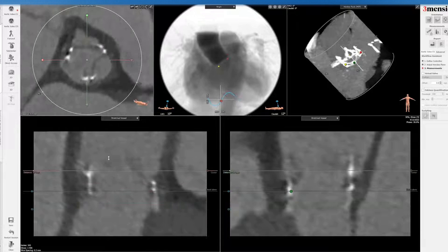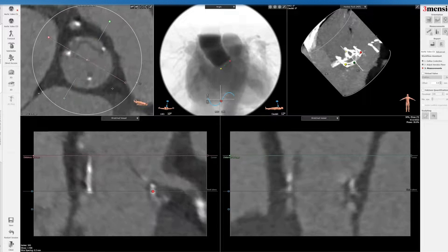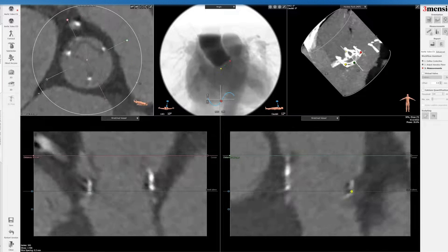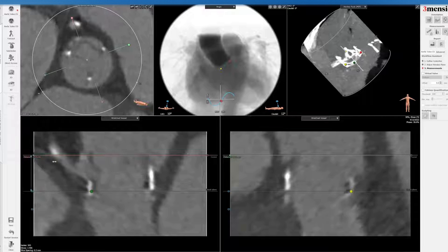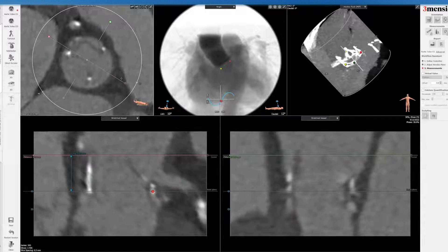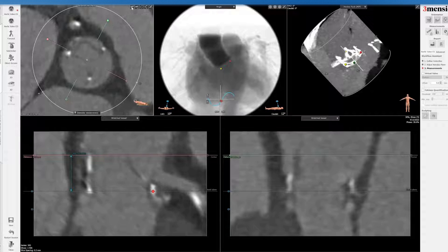I'm going to go up to the STJ. You can see this patient has a very small root. I'm going to use the open circle to swing around. You can see the sinus height is basically 10 millimeters. When you go to the left main, you can see that here. I'll use the ruler times two to measure the STJ, which is again pretty small — 23 to 24 millimeters.